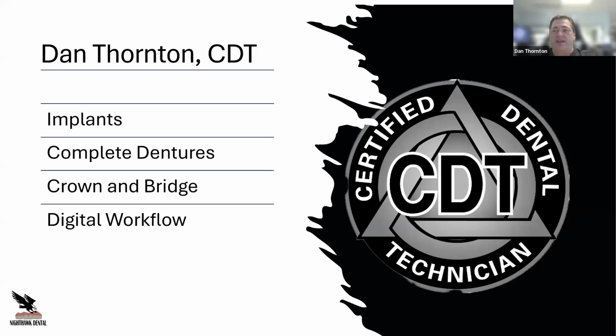With the stackable guides, you can actually still have the traditional guide for the surgeon with the implant placement, depth, timing, and everything else, and then go back to the traditional pickup. You can do that. Stackable guides just make it a little bit easier, and everything is pre-planned.